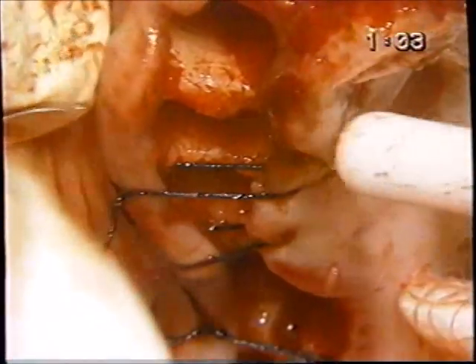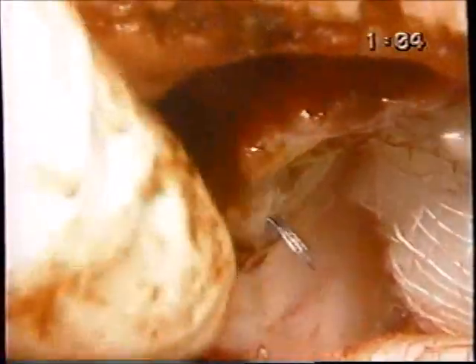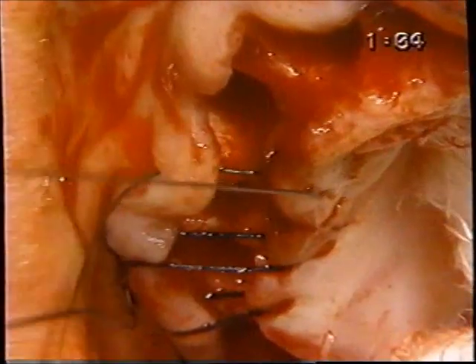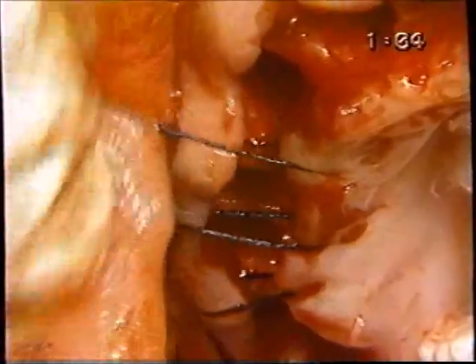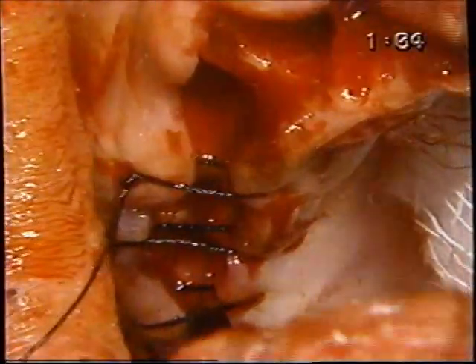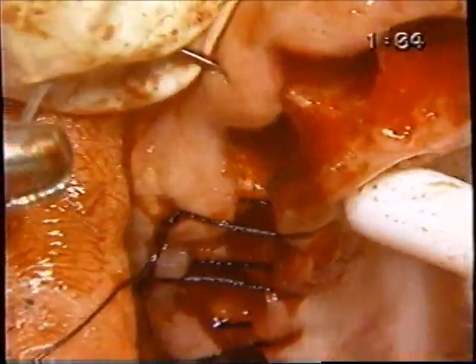We aren't necessarily trying to have primary closure at all, especially with the denture on this to protect it. We can have areas that will form clots, especially with the denture protecting it as a bandage, if you will. And we'll get very fine healing and quick epithelialization across these areas. People that feel like they have to have a linear incision postoperatively that goes from one side to the other, I think are probably removing more bone than is needful.